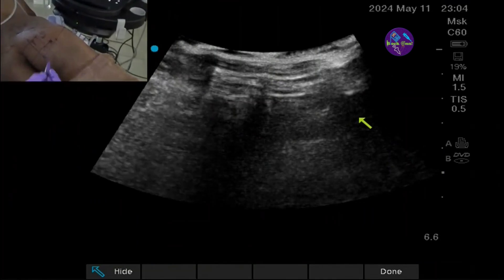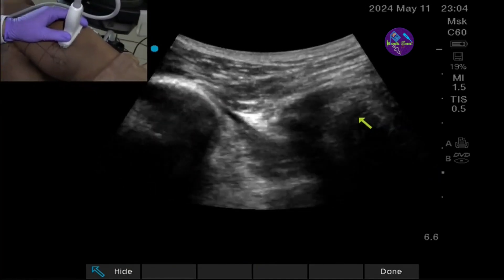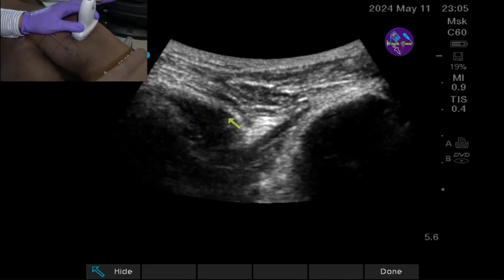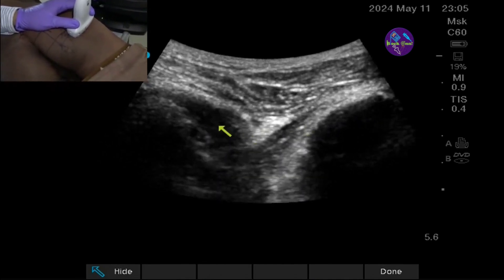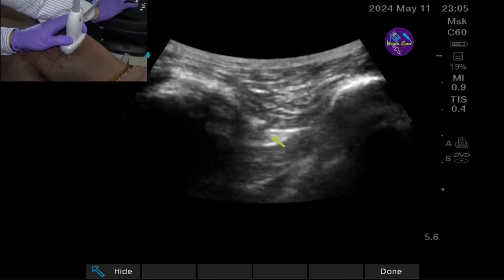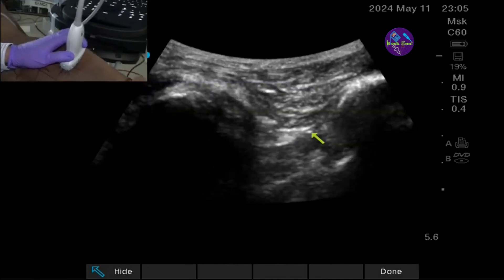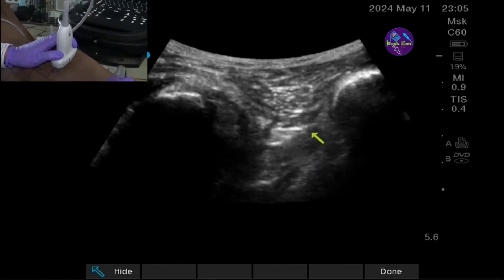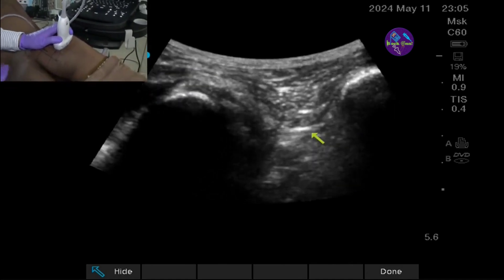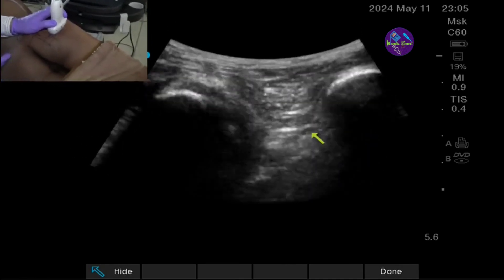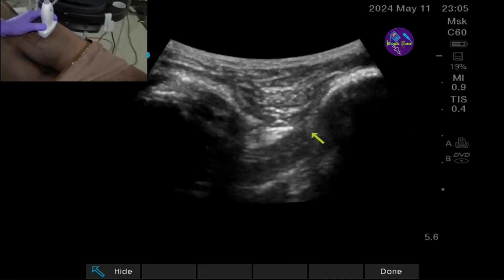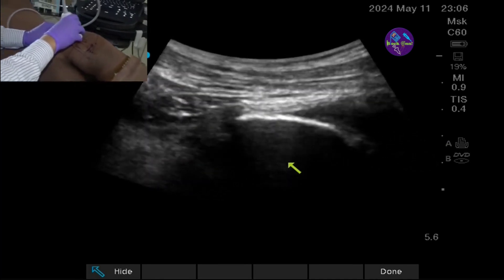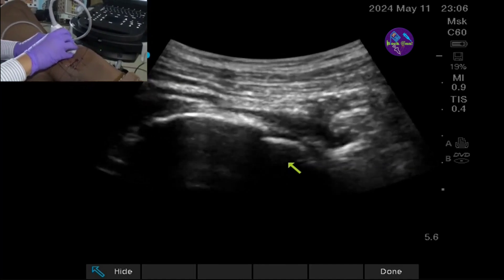Moving on to the GT-IT approach: keep the probe over the line joining the GT and the ischial tuberosity, indicator towards me. On one side is the ischial tuberosity. In between, you see a honeycomb appearance with a pulsatile inferior gluteal artery. This is the subgluteal approach — very easy for both PNS and ultrasound guidance. Because the gluteus muscle is thinned out here, it is useful even in obese patients. The muscle above is gluteus maximus and the muscle below is quadratus femoris.